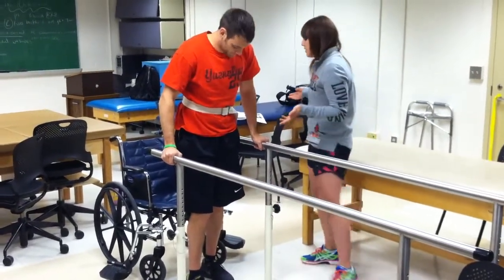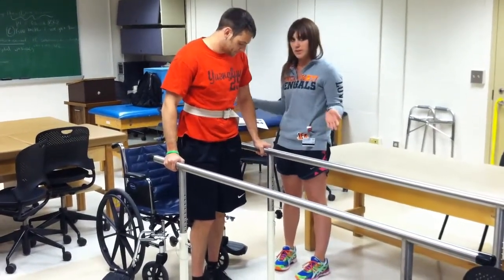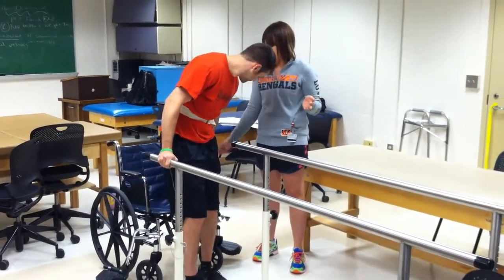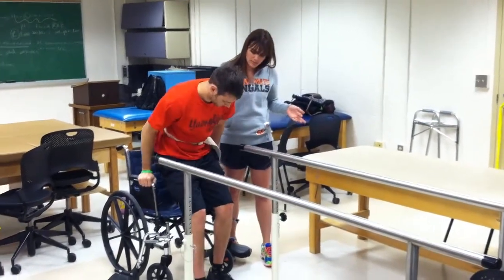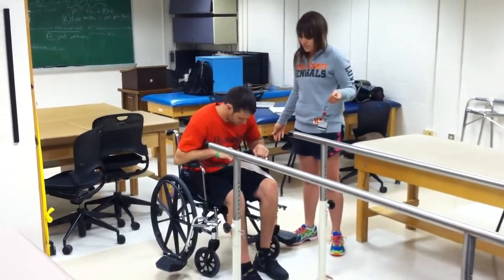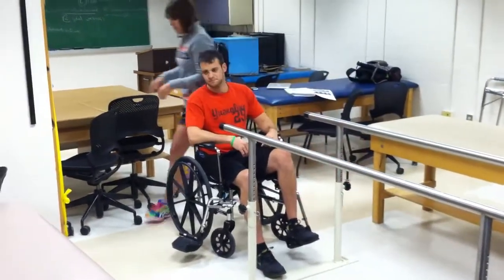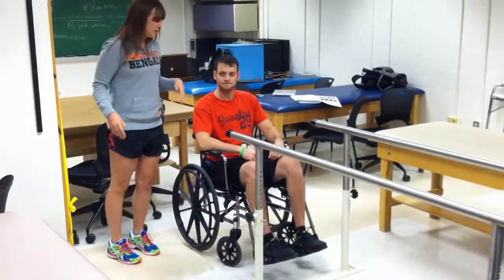Now we're going to have him sit back down. Make sure his back leg is close to the chair — it can be four to six inches away. Take your arm on your good side and extend it back and place it on the armrest. Flex your hip and your knee on that side, then do the same with your other side. Lower yourself down and scoot yourself back in the chair.